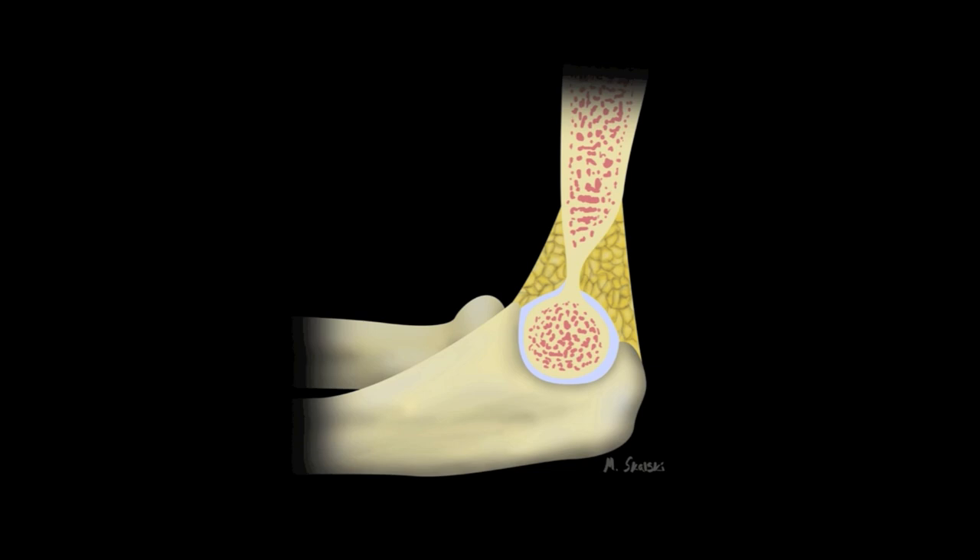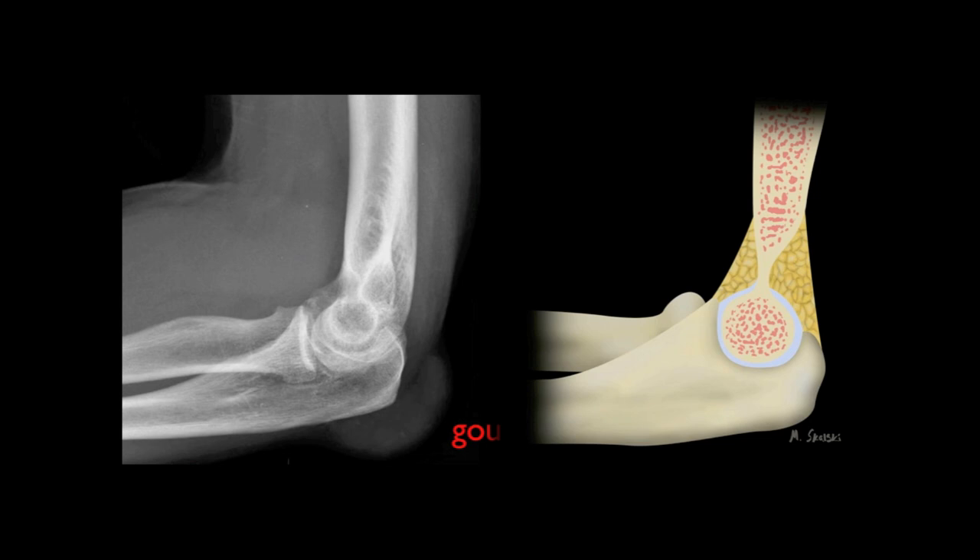Let's begin by looking at the elbow fat pads, which normally sit adjacent to the distal humerus, from which they are separated only by a thin reflection of joint capsule. The anterior fat pad fills the shallow coronoid fossa, while the posterior fat pad sits within a much deeper olecranon fossa. Here is a lateral radiograph of a patient with chronic gout affecting their olecranon bursa but without an elbow joint effusion. You can see the normal orientation of the anterior fat pad, visible just in front of and paralleling the distal humerus, appearing as a darkened area because fat is considerably lower density than the adjacent musculature.